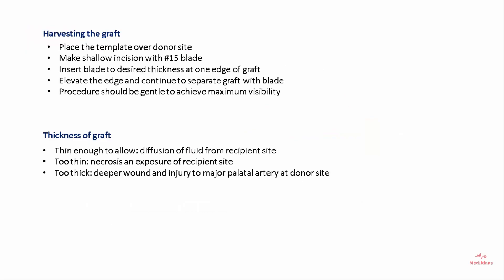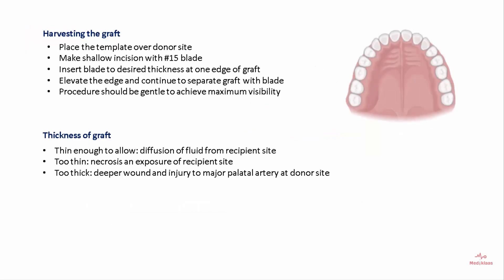To harvest the graft, place the template over the donor site and make a shallow incision with a number 15 blade. Insert the blade to the desired thickness at one edge of the graft, elevate the edge, and continue to separate the graft with the blade. This procedure should be performed gently to achieve maximum visibility.